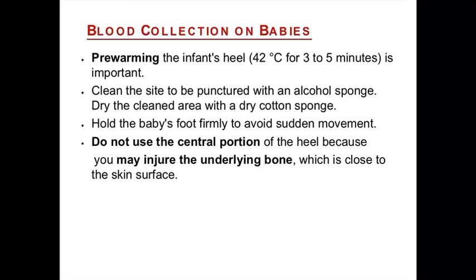Now blood collection in babies. Pre-warming of the infant heel to 42 degrees for 3 to 5 minutes is important. Clean the site to be punctured with an alcohol sponge. Dry the cleaned area with a dry cotton sponge, and hold the baby's foot firmly to avoid any sudden movement.